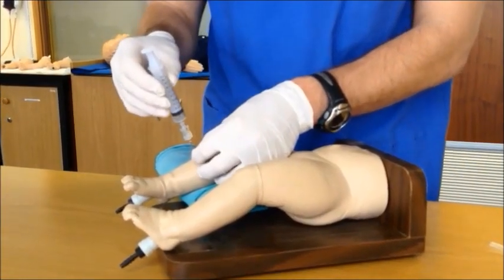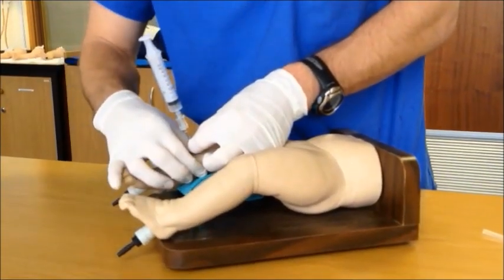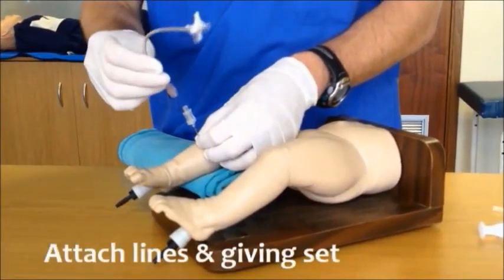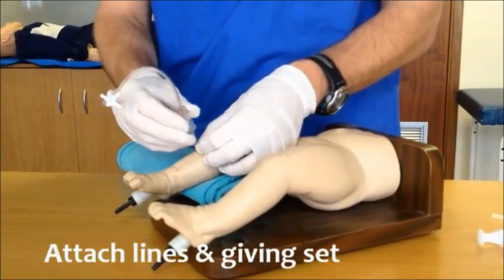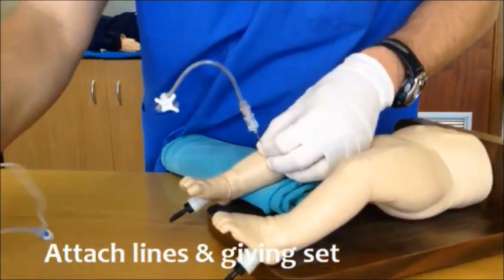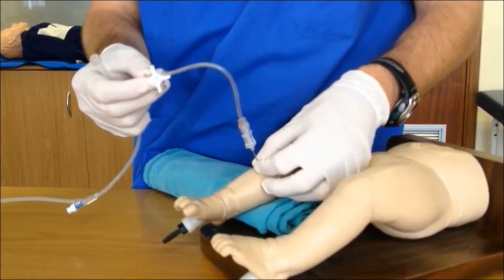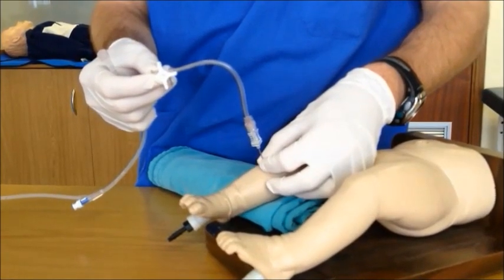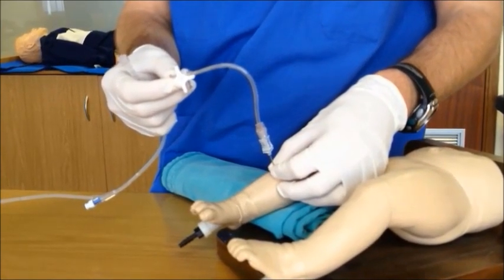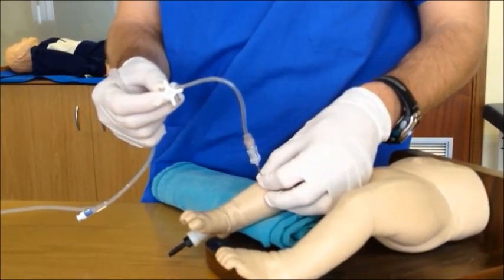Once you have confirmed position, make sure with visual inspection that there is no extravasation of fluid, and palpate the calves on both sides to make sure there is no extravasation into the posterior compartment. After the syringe has been removed, attach a three-way system and an extension set to the needle. You would connect your intravenous fluid and giving set to the three-way tap system and extension set. An assistant would now take over securing the needle. We recommend that you maintain manual control of the needle until all the initial essential life-saving drugs and fluids have been given, as securing the needle to the leg itself may cause dislodgement.